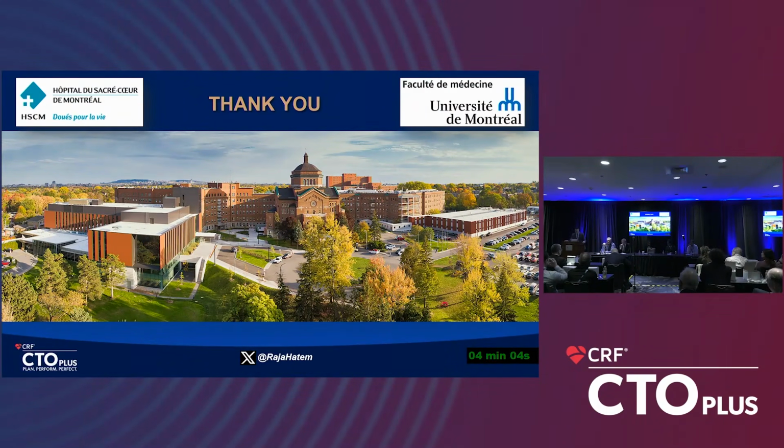Exactly. So confirming you're in the true lumen, not by tip injection. Everybody get tip injection out of your head. When it comes down to XTA or Gladius, function follows form. And so the other thing that Raja has so beautifully taught you is you have to know how these things are built. If you're just picking them up because it's the next one on your list of things to try, you're never going to learn how to solve a problem that you're faced with in the middle of the case. So I thought that was really nice that you would teach everybody how these things are made. And Asahi is more than happy to come to your lab and teach you how these things are made so that you can use that information to iterate in the future.